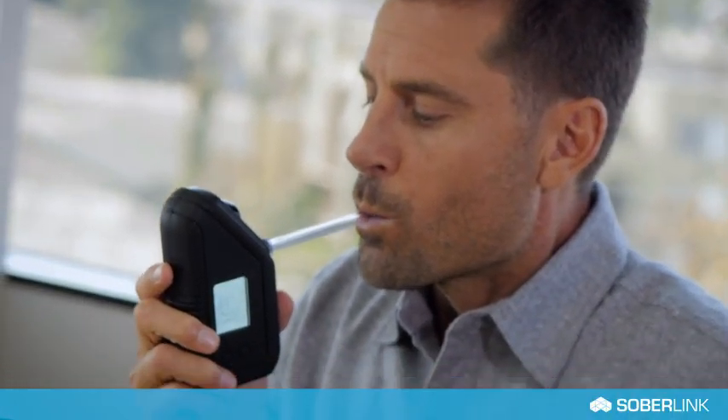When prompted to blow, look directly into the camera. Breathe in deeply and deliver a firm, continuous breath for four seconds. The device will click when the test is complete.